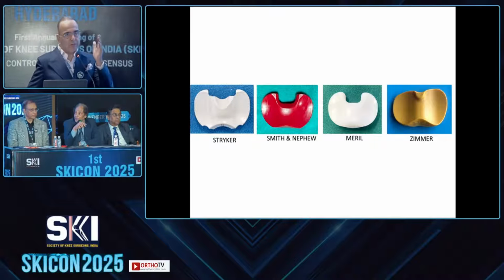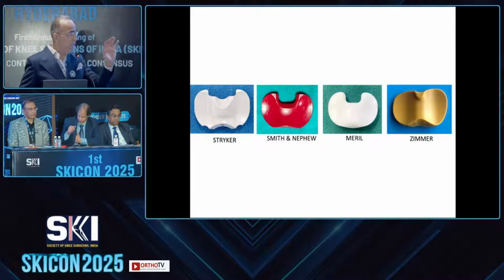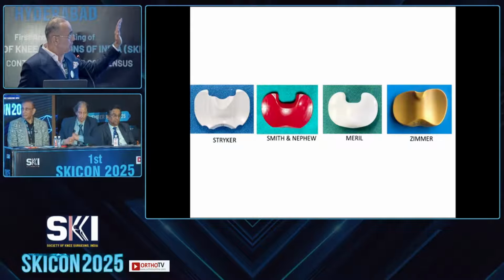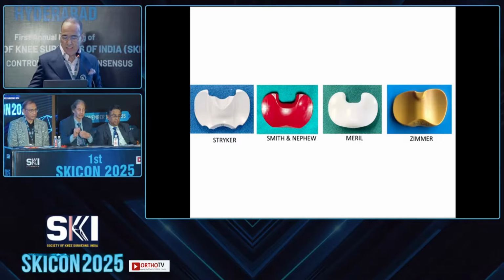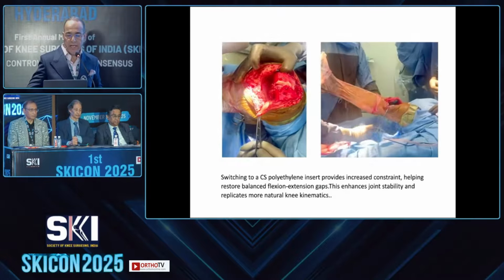Yeah, so the point I was trying to make is that all UC polys are not the same. And with every make, there is some difference at the back of the UC poly, and you need to be cognizant of what you're using and whether you have to take off the PCL. So as you see, the back of all of these inserts is slightly different, and some of them mandate that you take off the PCL.